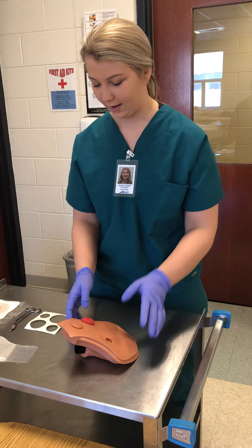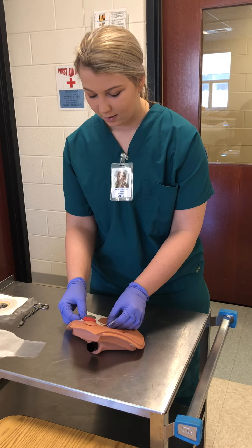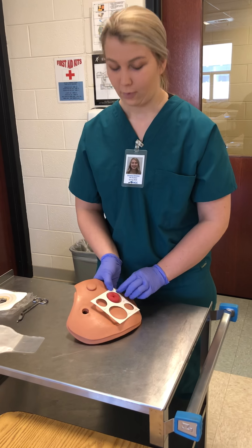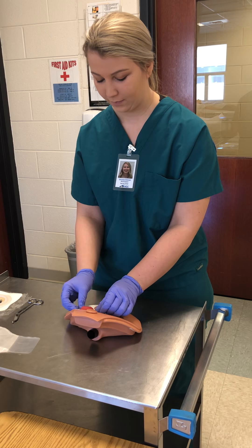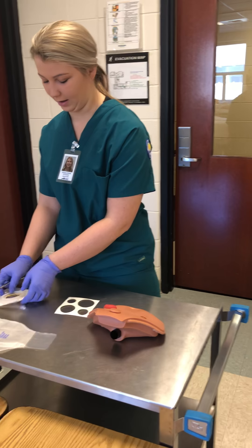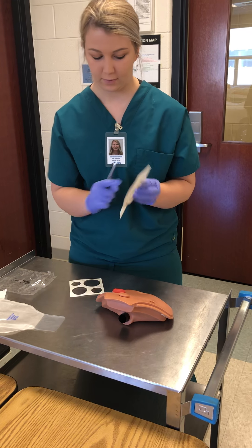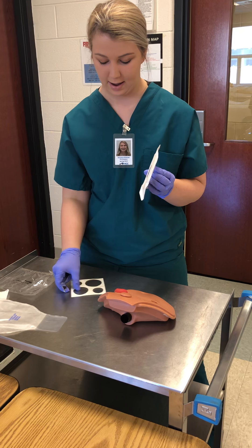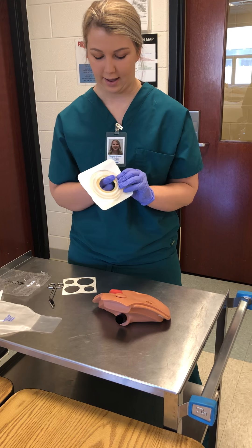Now that I've assessed the stoma and the skin around it, I'm going to measure. You want to have about a one-fourth inch between the stoma and the new wafer. I've measured it. Now I'm going to take it to my wafer — sometimes they're already pre-measured. This one already had the same measurement on it, so I'm going to cut it out and smooth it down.